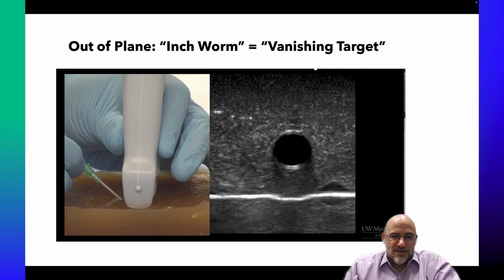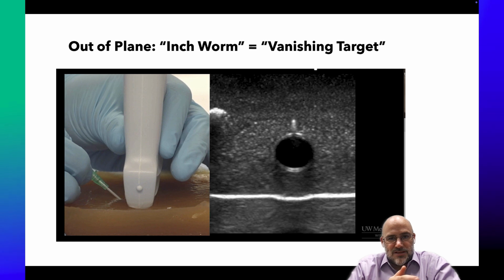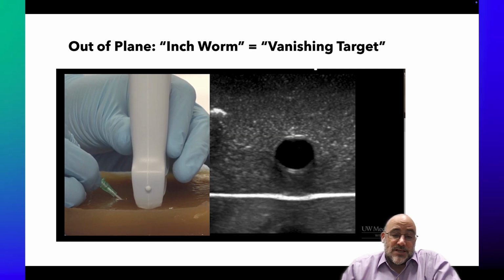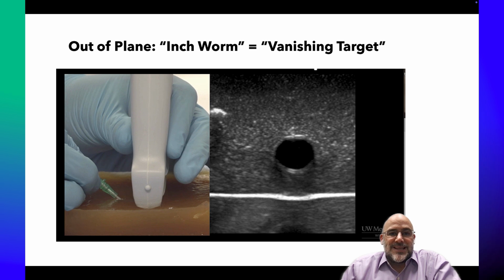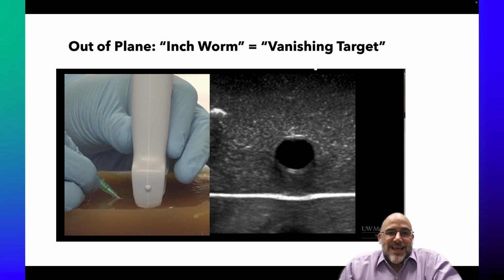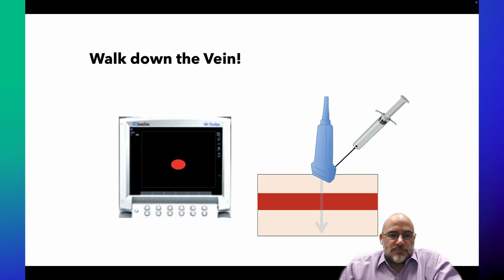Here, this person is kind of following their needle tip. You can see that their transducer is running to catch up to their needle tip. That's not what I would recommend. You want to lead the needle and you want to always see nothing, which is to say not see your needle, and then use your needle to enter into that space.